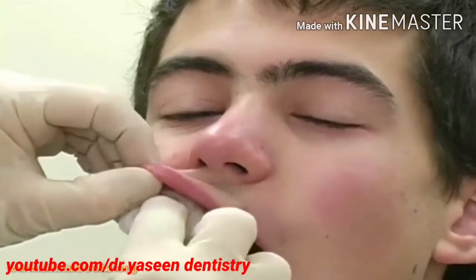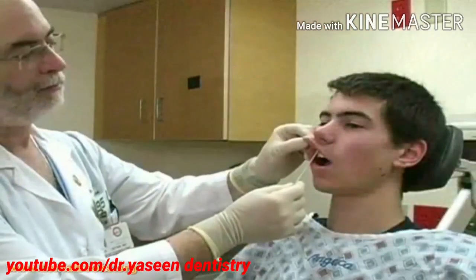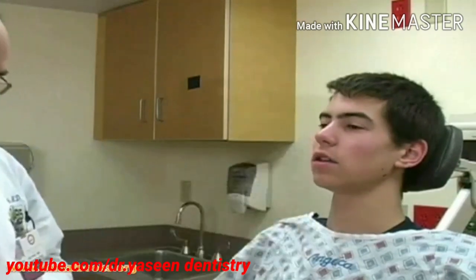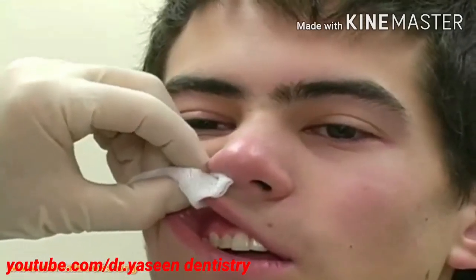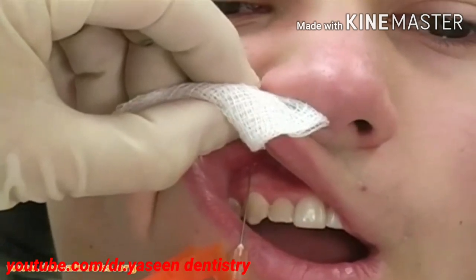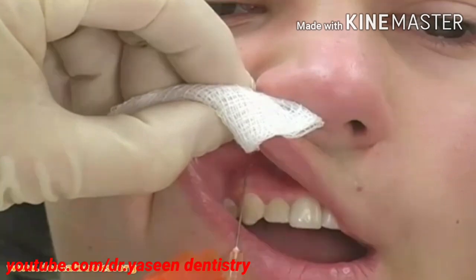Dry the buccal mucosa around the area with a piece of gauze, and then apply a topical anesthetic such as benzocaine. Instruct the patient to close the jaw slightly to relax the upper lip. Use a piece of gauze to retract the lip anteriorly. Insert a 3.5 centimeter 25 gauge needle in the mucosal reflection at the apex of the canine tooth.